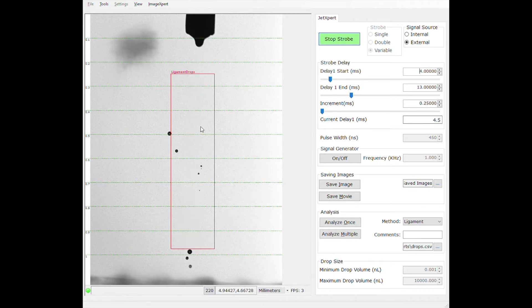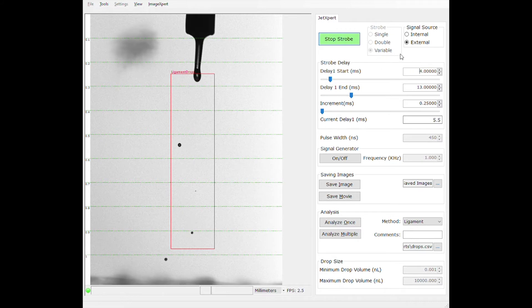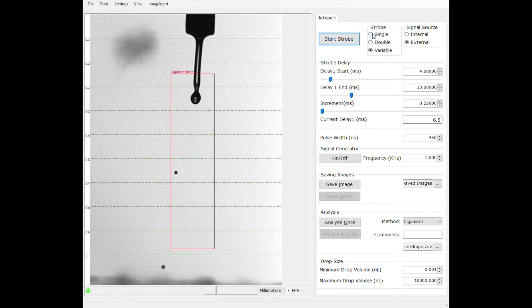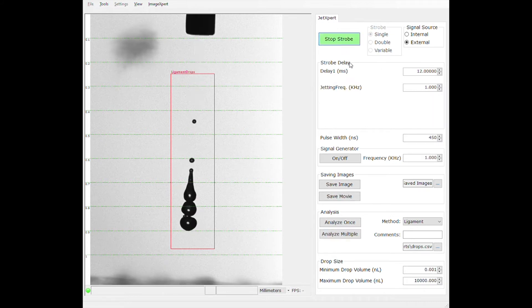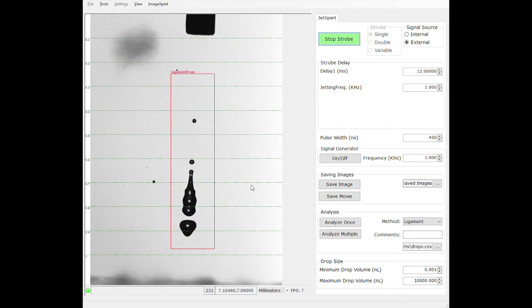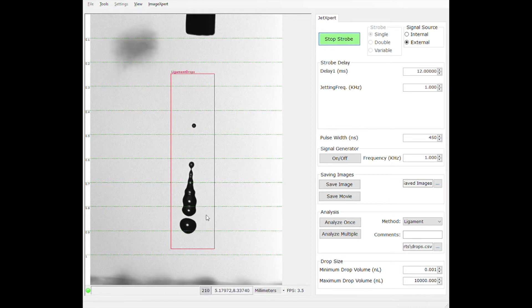We can also use a method called single pulse. What this does is visualize the drop at the same moment in time from one picture to the next. This is also useful for analyzing the stability of the drop over time.